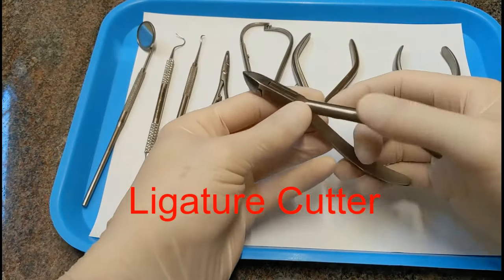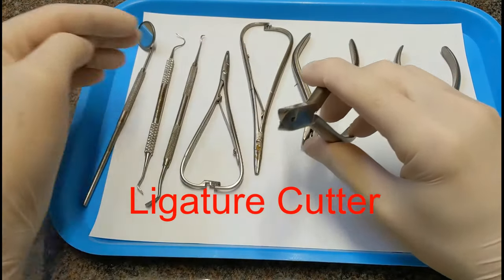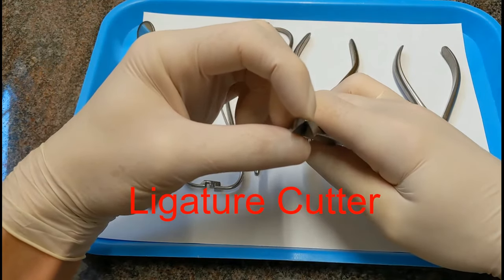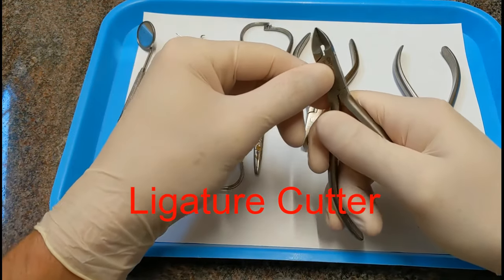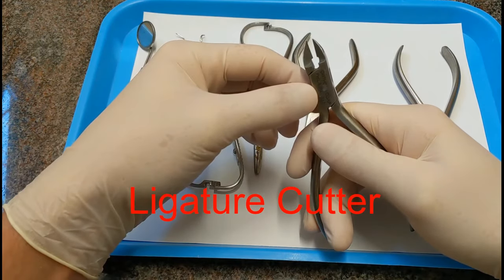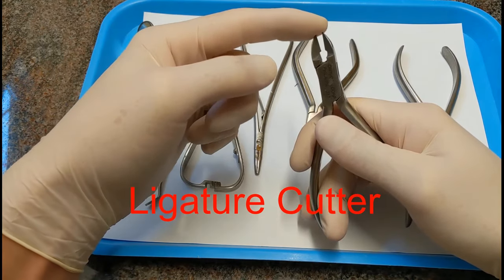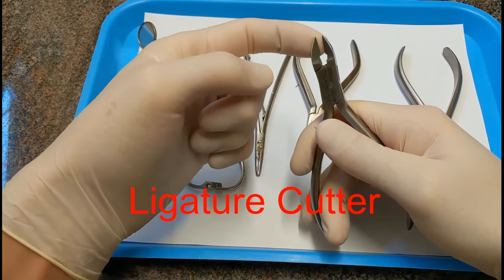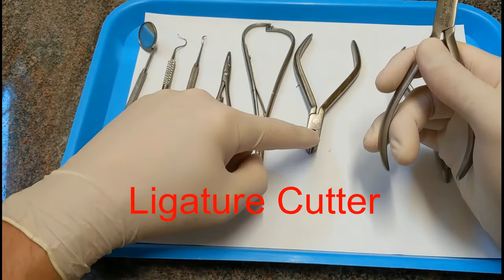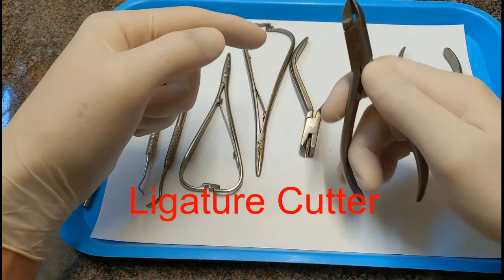This is called a ligature cutter. It's like a wire cutter, but much more expensive. It has flush-cutting blades and is for cutting ligature tie and skinny wires. You can cut zing string with it, you can cut chain with it. You don't want to cut arch wires with this because the blades are more delicate and it will wear them down. For cutting arch wires, use a distal end cutter. This is for anything lighter weight than an arch wire.